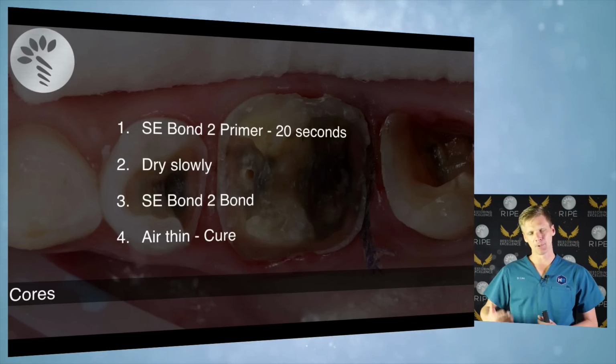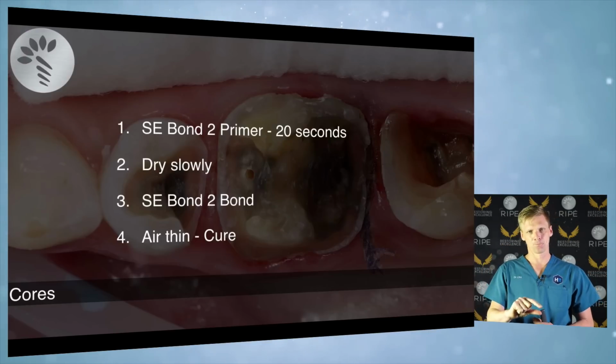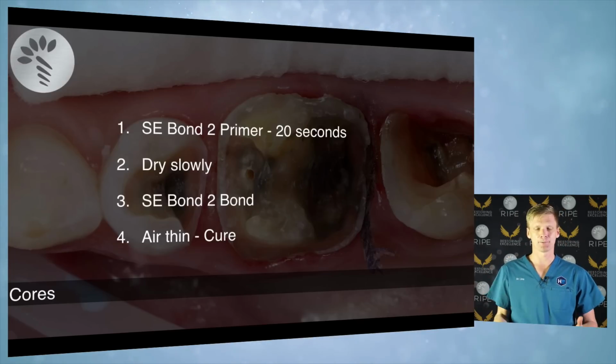The reason I air thin it is because I don't want to ever see an X-ray where I can't tell whether it's caries or the bonding agent. If you leave bonding agent thick, it doesn't affect the actual strength, but when you take an X-ray, you can see a big black line, and it's impossible to tell whether that line is caries or bonding agent. So I always thin it down.